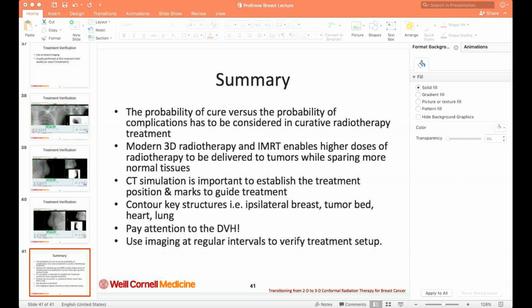Make sure, sometimes we have patients whose chins come down, and if the chin is being treated and is in the way, that's a problem. So make them tilt the chin up and out of the way. One thing you can do is to use the light field as well, to do a rough approximation that you're in the correct place.